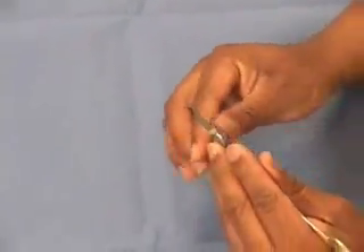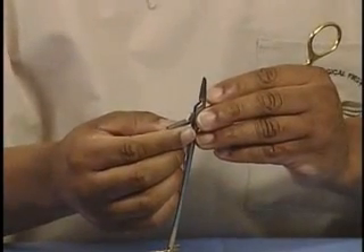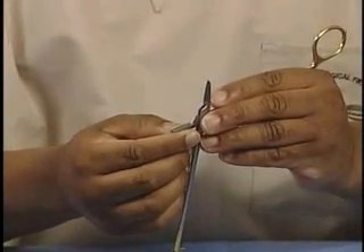If you look inside the jaws, you'll notice that there are serrations. This gives us better control over suture material and also various types of needles.